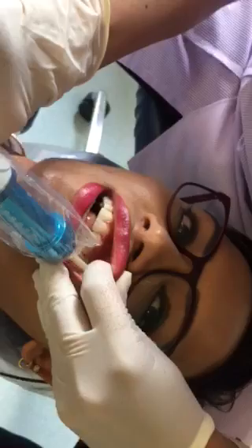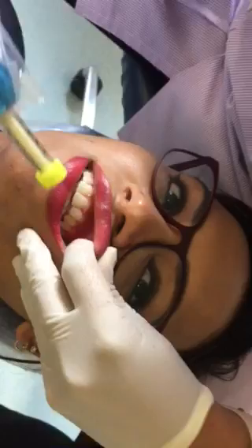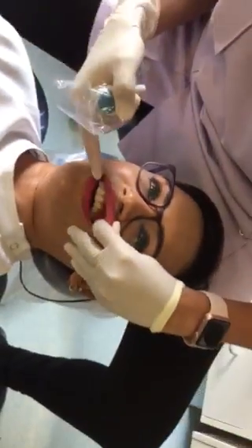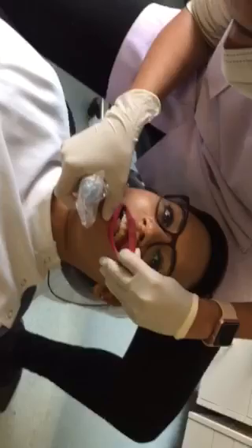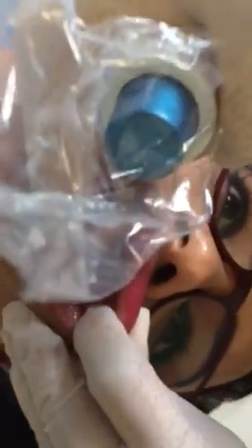Okay, so the sulcus — press it now, just press it firmly. Is that it? That was amazing! Did you feel anything? Just like a knock on my teeth, but that didn't hurt at all. Is it working already? Yeah, that's it. You see the red spot there? Yeah. That's normal — that happens even with a regular needle. That was amazing.